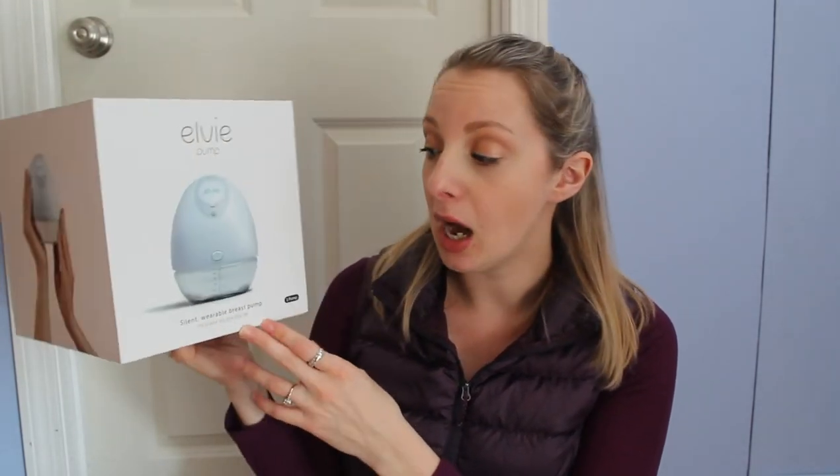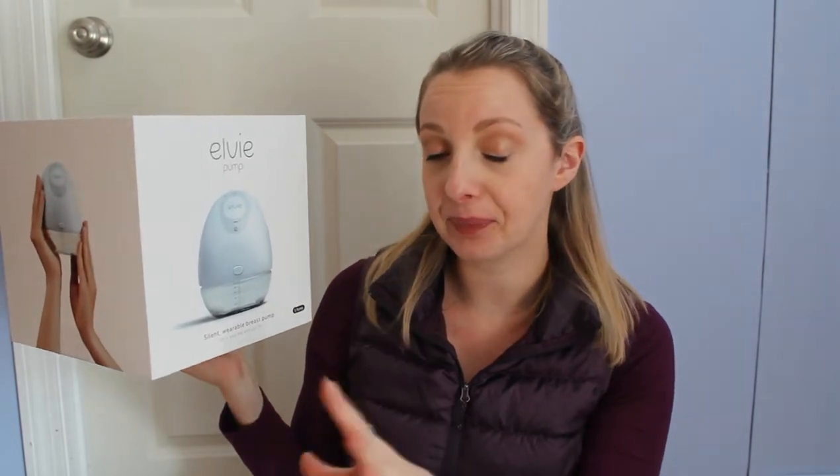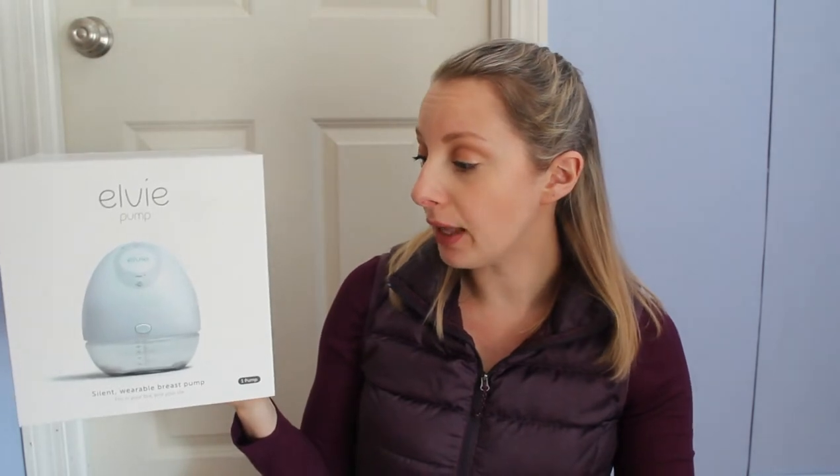I did only purchase one pump. I love that with the LV company you can just purchase one pump — for cost reasons or if you single pump, you're allowed to just buy one. I love that the Willow doesn't offer that option yet, but this is the pump that you can wear in your bra.